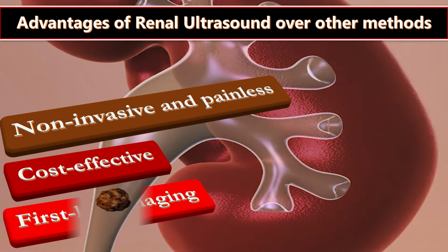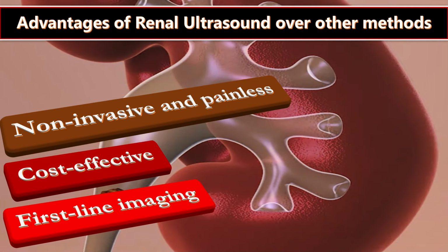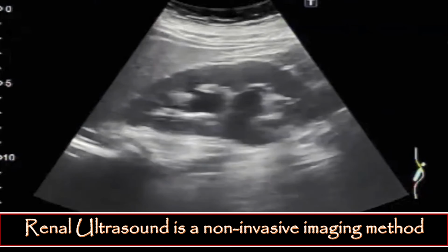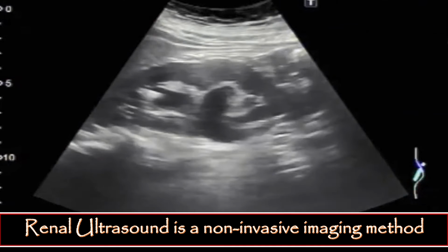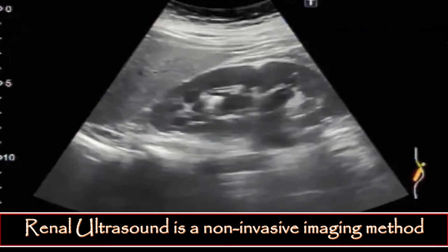Thirdly, it is a first line imaging. Many guidelines recommend ultrasound as the initial imaging method for suspected kidney stones, especially in cases of suspected obstruction. Renal ultrasound is a non-invasive imaging method which uses high frequency sound waves that bounce off the organs and internal structures, echoing back to form an image that can be captured and studied, such as to check the presence of kidney stones.